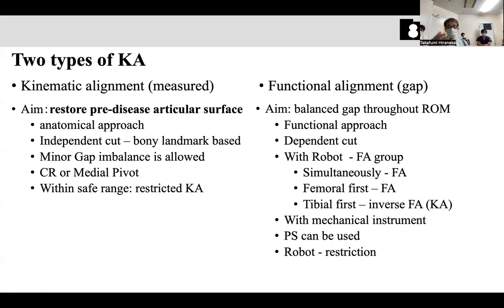In this approach, gap balance is very important to make the modern hinge joint function. So in this approach, many surgeons use PS and the gap balancing technique.